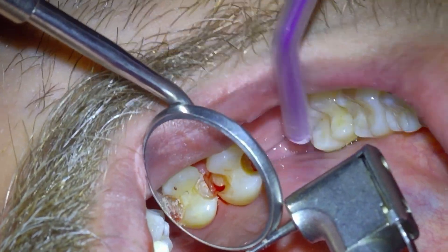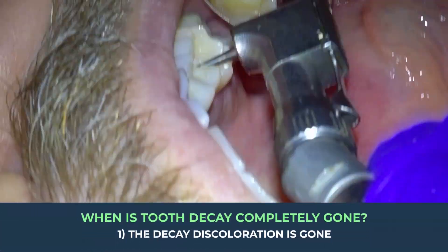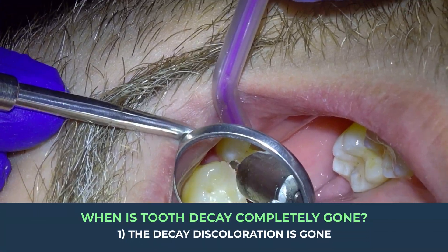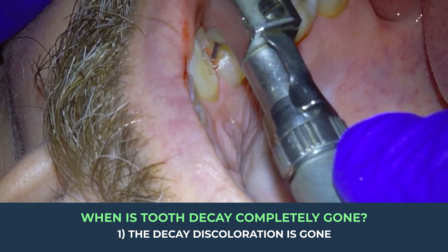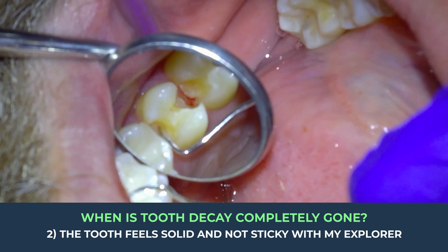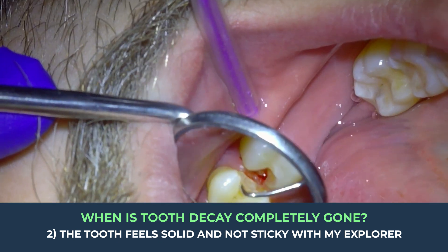There are three ways I confirm that the decay is completely gone. First and obviously, that decay discoloration needs to be visibly gone — but that doesn't tell us for sure that all the decay is removed. Second, I check with the explorer to see that the tooth feels solid and not sticky with that pointy instrument.